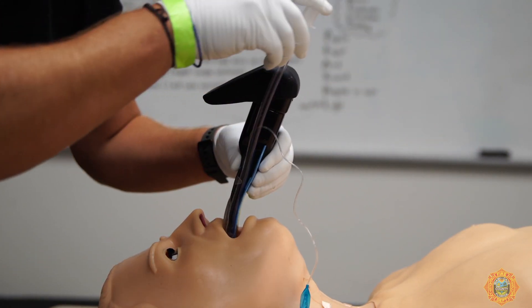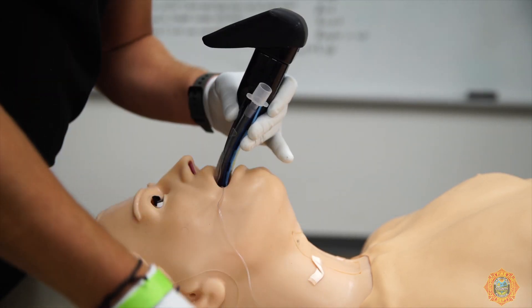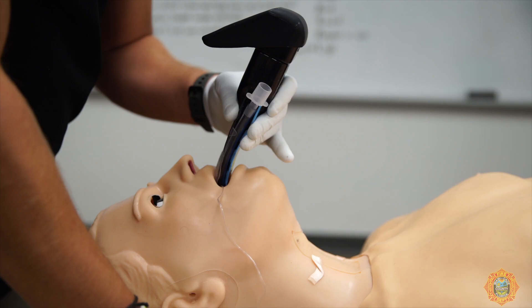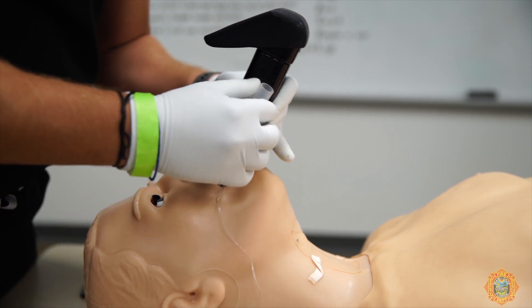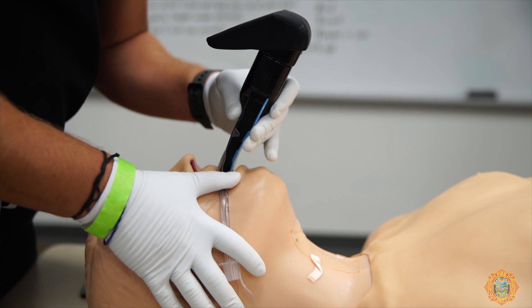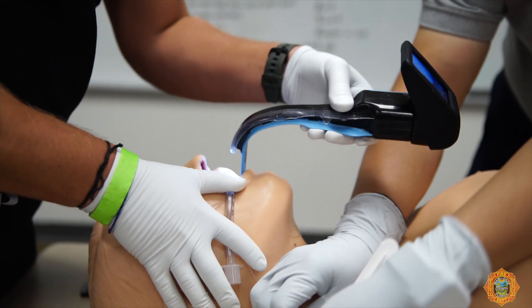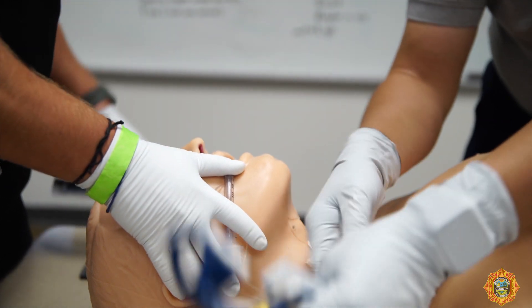Gently advance the ET tube inside the channel and check the depth of insertion. Inflate the ET tube cuff as performed normally and check for proper positioning. Separate the ET tube from the AirTrack SP blade by pulling it laterally or to the side of the mouth while manually holding the ET tube in its position. Remove the AirTrack SP from the patient's airway following the midline.